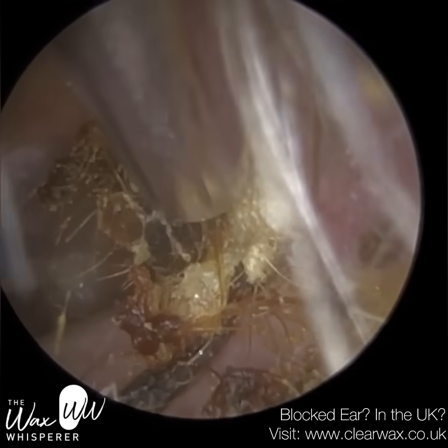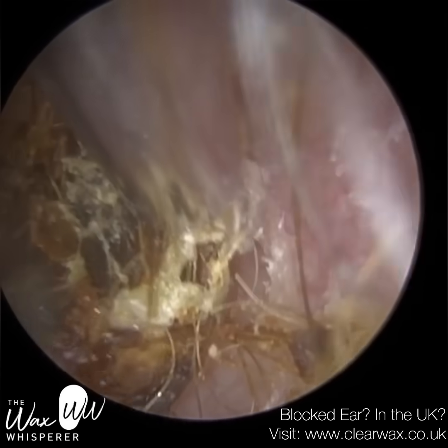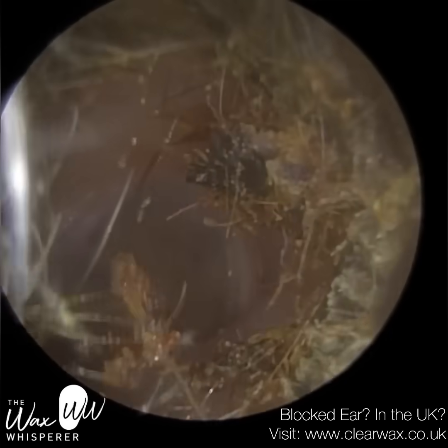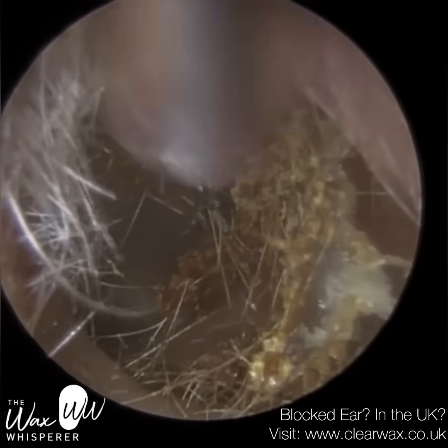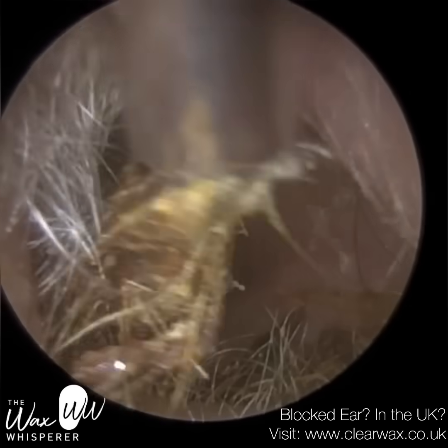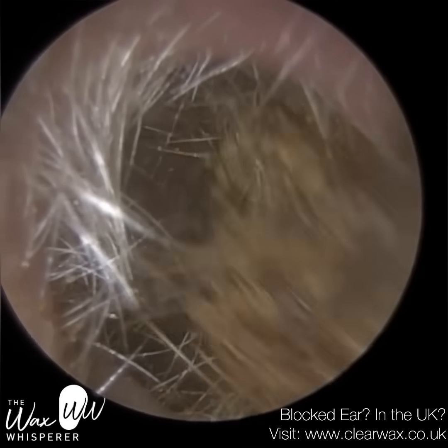You'll compare it to this patient's left ear. This ear is absolutely fine. There's no retraction. The incus, it's not as visible as a result because the eardrum isn't sucked in. But this is completely as it should be, and it's a good comparison compared to their right ear.